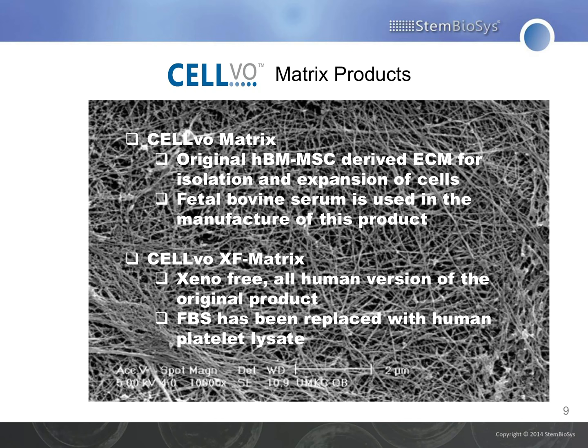So I hope that was much more clear in terms of the way that we process and build this extracellular matrix. And what I'm showing here on this particular slide in the background is a scanning electron micrograph of what that finished product looks like. So you can see that extracellular matrix that's been built by the cells.